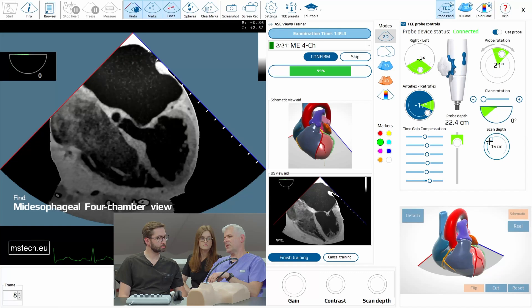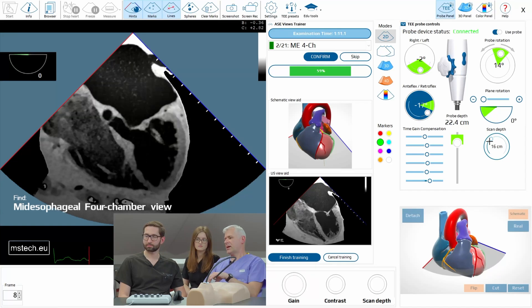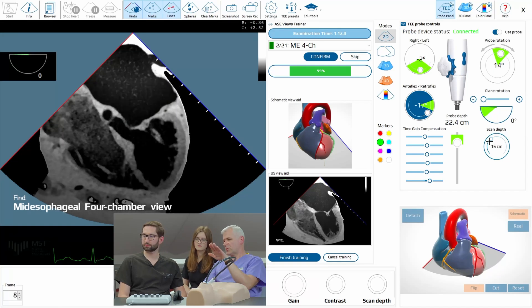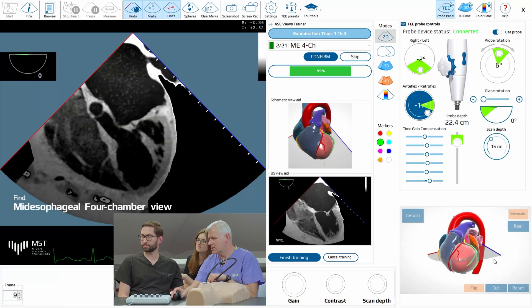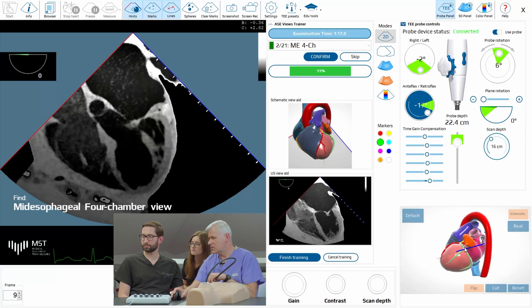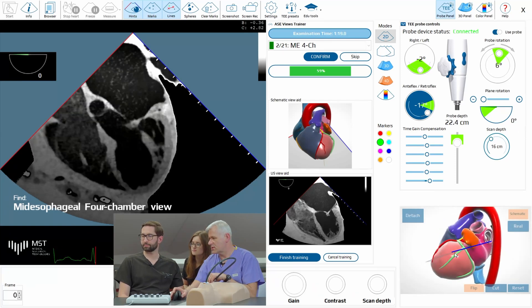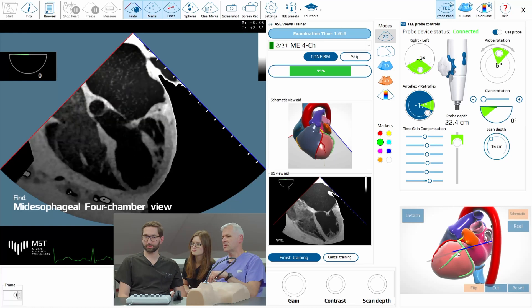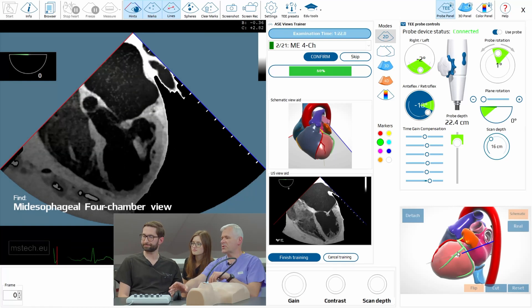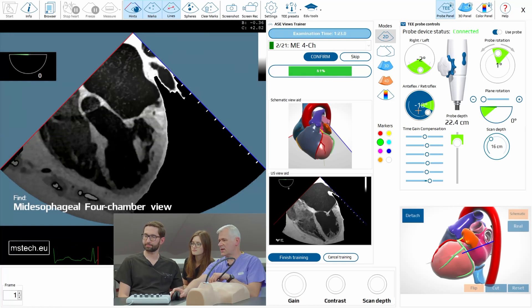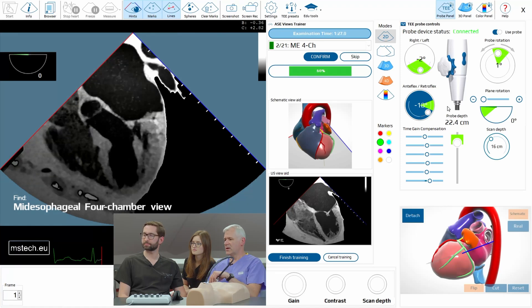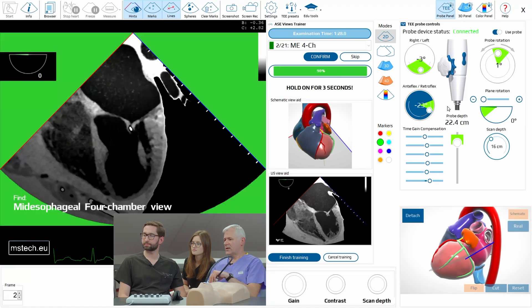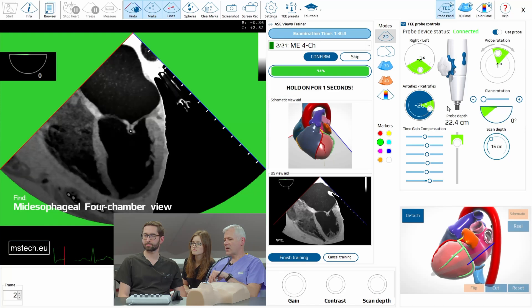So if I have five chambers now and I want to go more posterior — look at the image here — I'm not coaxial with the model, so we have to do retroflex. The machine suggests this is the zone where you should be trying to be. And you see I'm getting green color, and it's done.